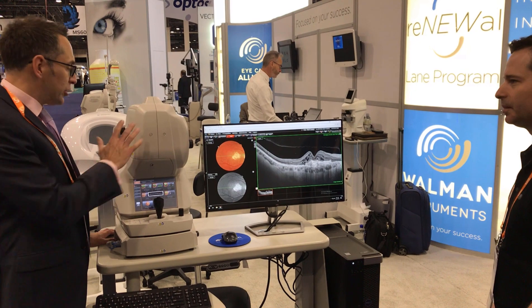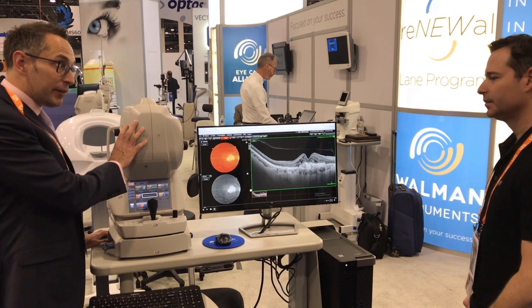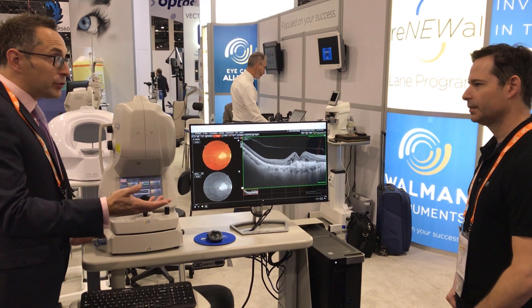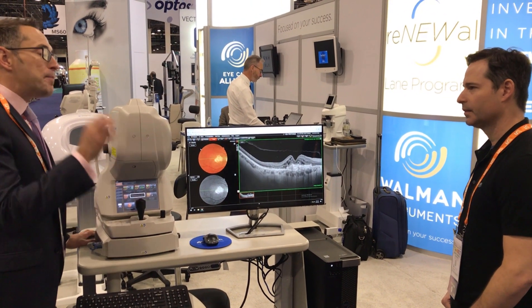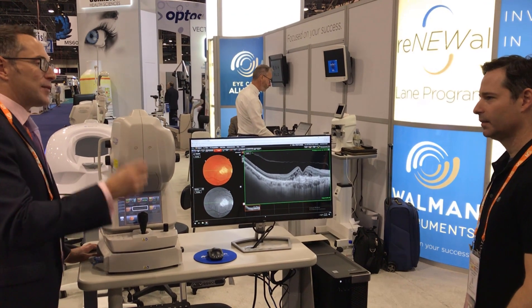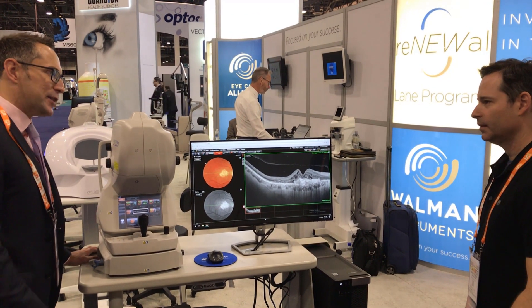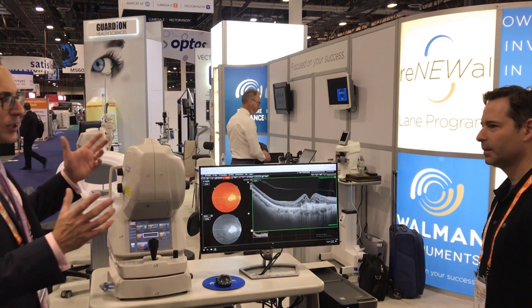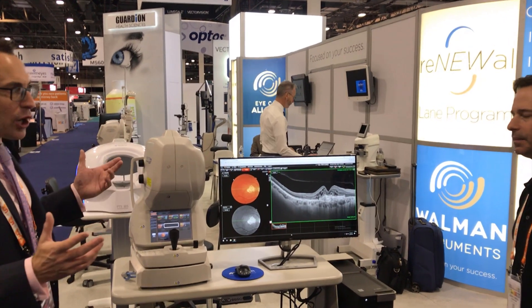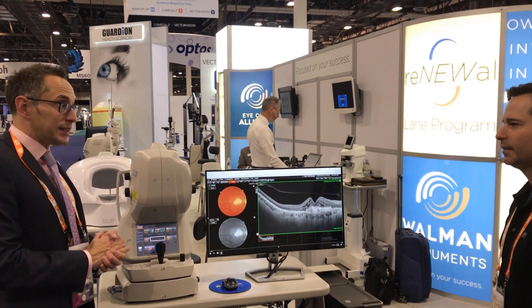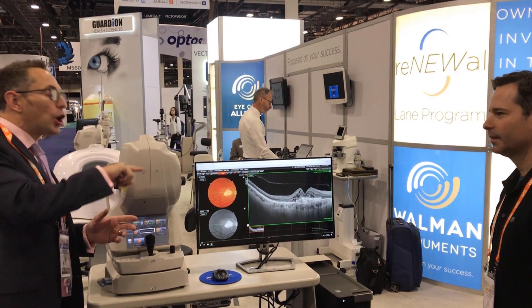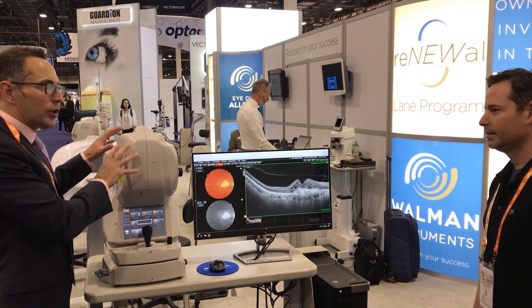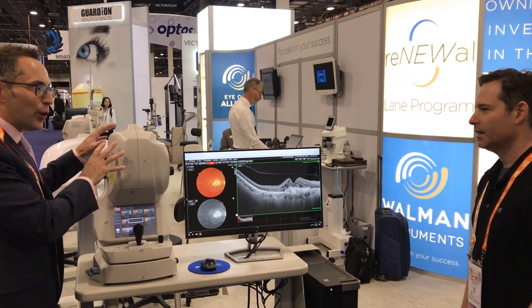We can capture, using our anterior attachment, an image of the ora serrata by penetrating the sclera because of that 1050 nanometer wavelength. You may have seen in various advertisements around the shows — we had a symposium yesterday — a total globe image. This machine captured that total globe.